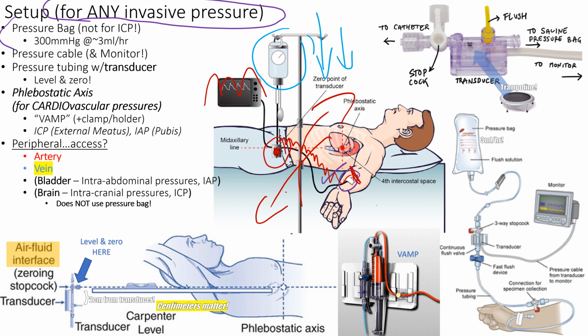So that's not that much, but it's still something to consider. 72 cc's every day. I mean, there were some people back in the day who were charting the 3 mLs for their I's and O's. I mean, it makes sense in like NICU, because 72 cc's is a big deal. But in adults, it's not great. I mean, they can blow that off in 4 hours, right, by diaphoresis. All right, but either way, you've got 3 mLs an hour of fluid that is getting put into the patient.